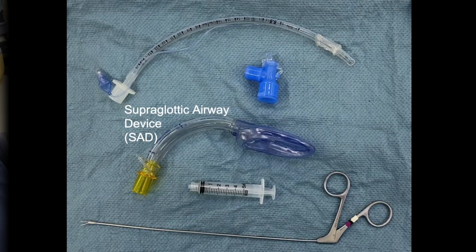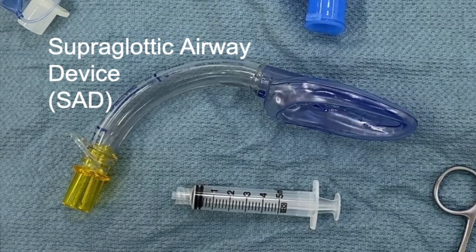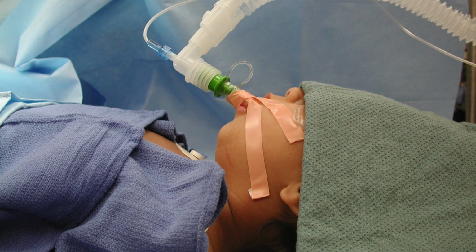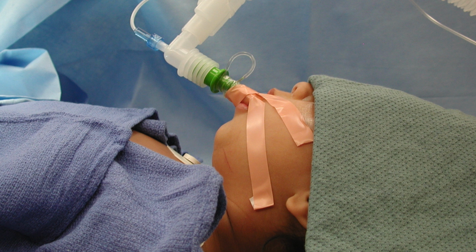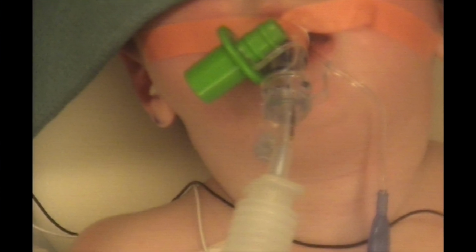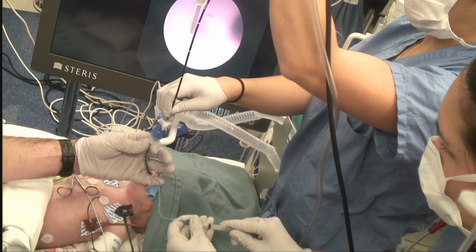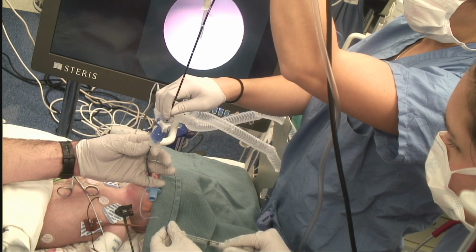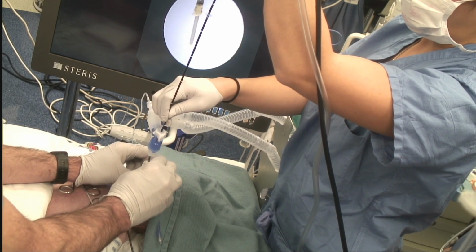Next, a supraglottic airway device that is specifically designed as an intubation conduit is strongly recommended. These specialized devices have airway conduits that are shorter in length yet wider in diameter. The shorter length allows the tracheal tube to be placed into the correct position in the trachea while still leaving the circuit adapter outside the device. This permits continuous connection to the circuit as the tracheal tube is advanced and positioned in the trachea.